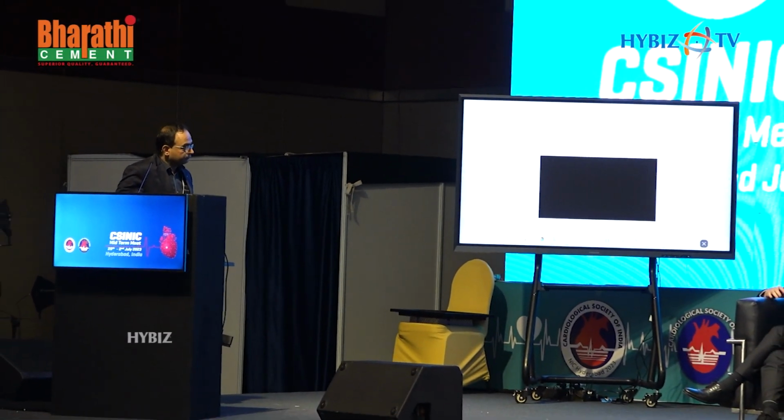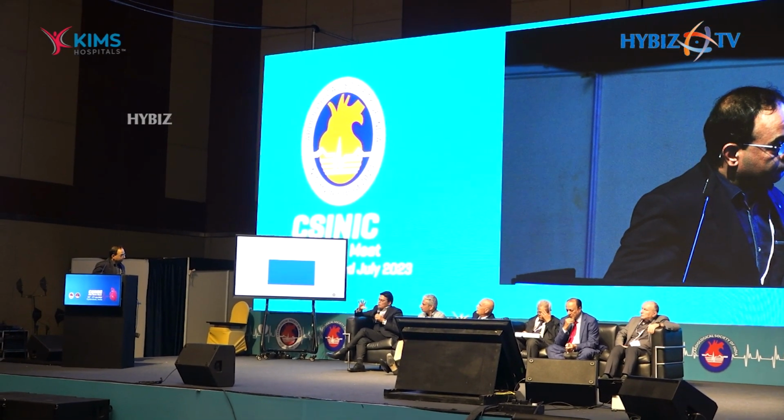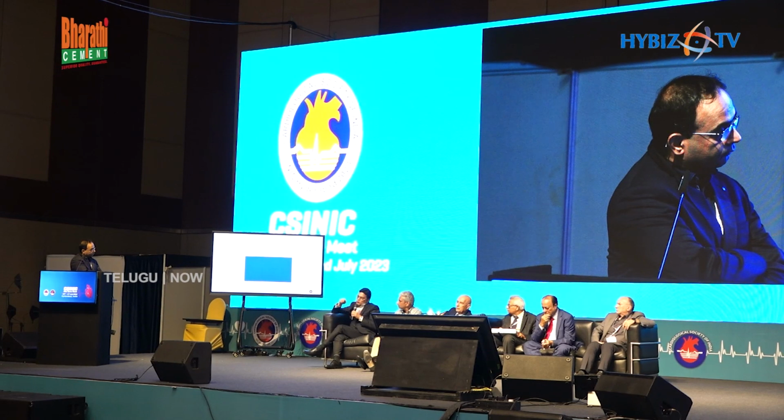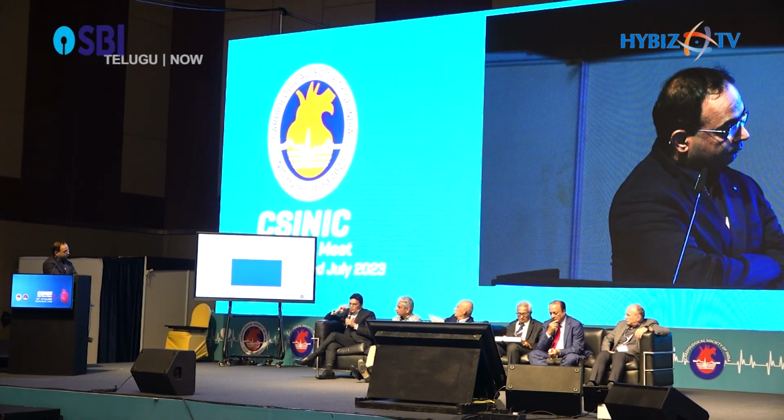If you see the first run of the OCT in the left main, that is not a minor malapposition. It is a major malapposition. It is more than 30% of the area, and even if you measure the distance between the stent struts and the wall, it will be more than 300 microns. If you leave that malapposition, what happens? When you do the next procedure, or if you are passing the wires, most of the time the wire can go abluminally. That can lead to stent deformation, and this can lead to shortening of the stent. Once the shortening of the stent takes place, it's very, very difficult to pass the wires. You will have a very tough situation.